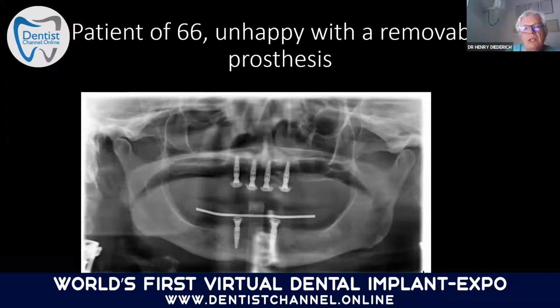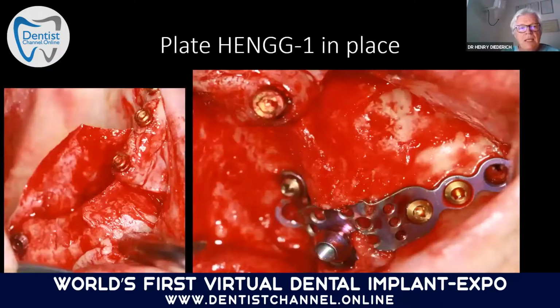So you imagine now in this situation to have a treatment with a very fast result. You will put them with implants. You will put here your hybrid plate.